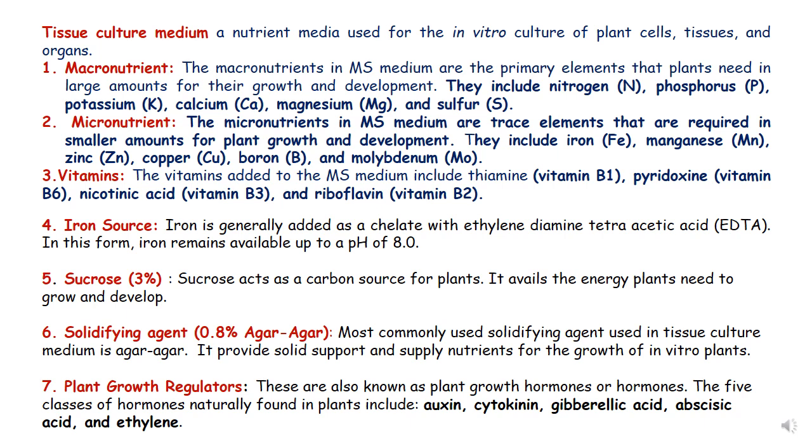So besides the first four components, that is macronutrient, micronutrient, vitamins, and iron source, nutrient media consists of sucrose in the percentage of 3%.